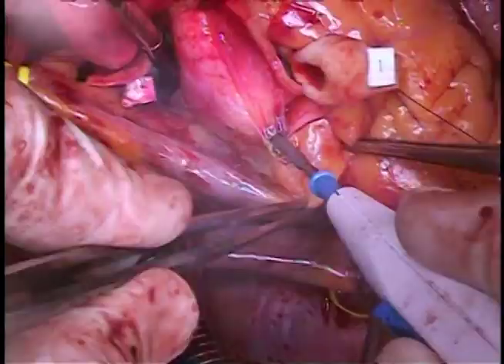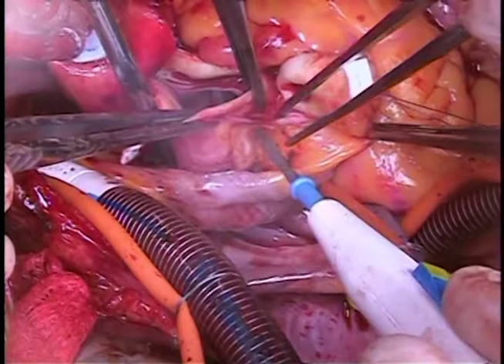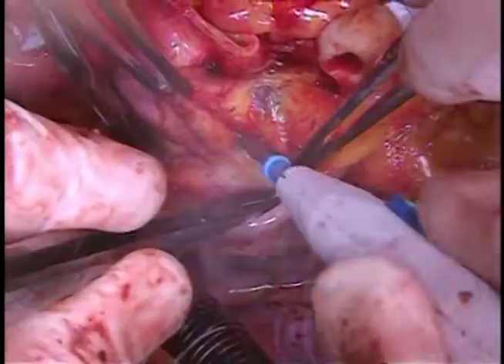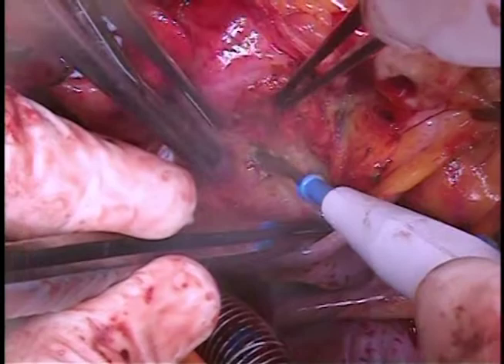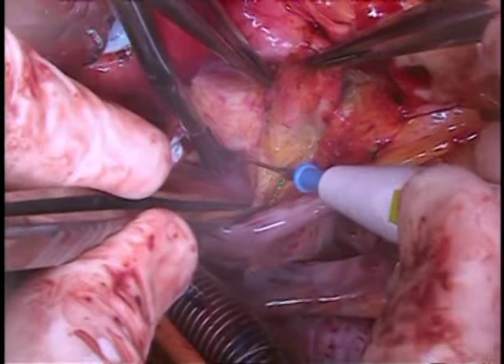With the buttons fashioned, you can now more deliberately dissect around the aortic root. Light cautery is helpful here since you'll find yourself dissecting off muscle fibers of ventricle anteriorly and left atrium posteriorly. In the words of one of my mentors, you're not low enough until you've made a hole. There's some truth to this since you need your subannular stitches to go as cleanly through the aortic tissue as possible. If you do identify a tear, recognize and suture it closed at this point. Always take a final look around the aortic root for a last hemostasis check, as you will not visualize this region again once everything is constructed.